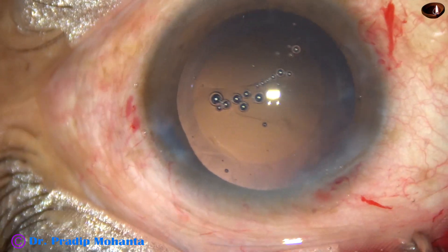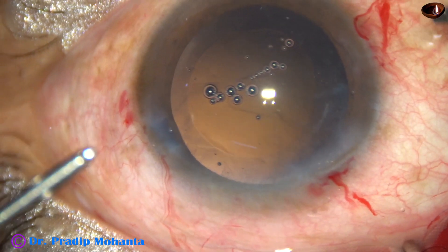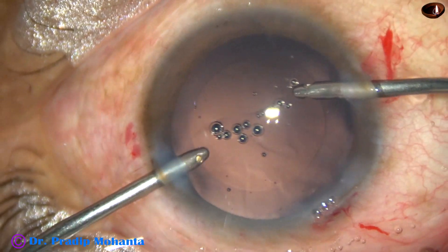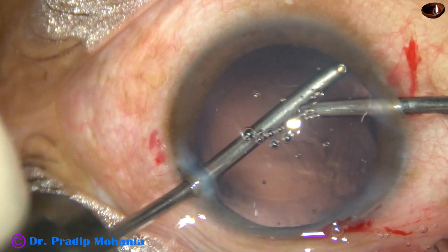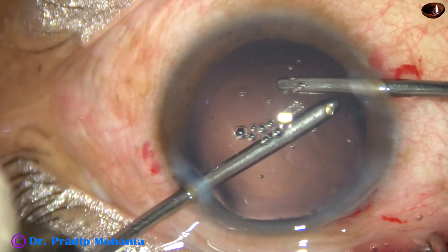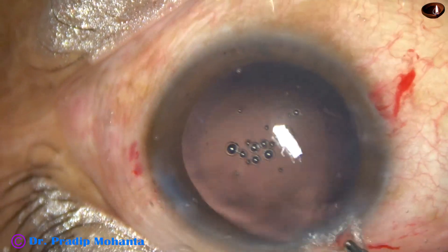Yes, it is done. I find some residual cells from 8 o'clock to 11 o'clock. So I go through the right side port with aspiration from the left, and in IA2 mode I do some polishing of the equatorial and peripheral part of the capsule from 8 o'clock to 11 o'clock.